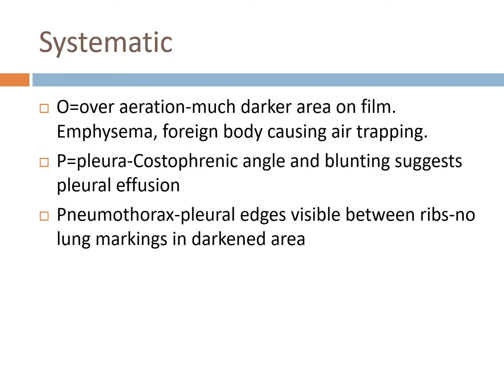Some of the processes that could cause this would be a lung consolidation, pulmonary edema, non-obstructive pulmonary atelectasis, interstitial lung disease, a neoplasm, and even normal expiration.